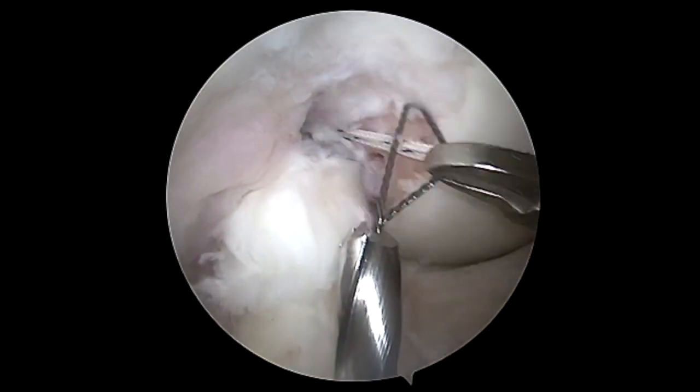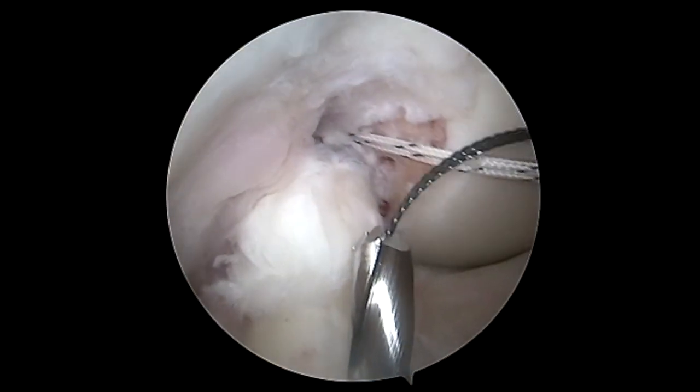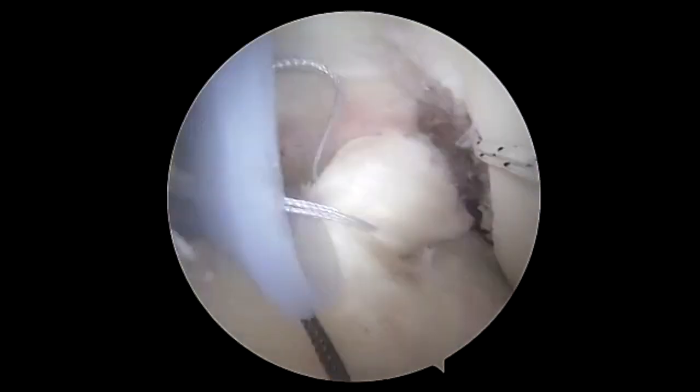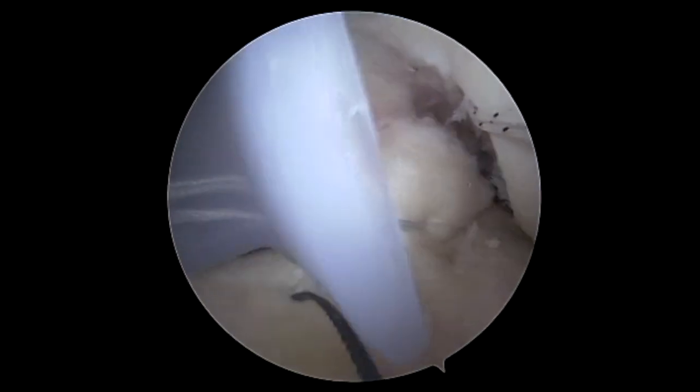This is a cannulated drill. You can see we're grabbing this out of the lateral portal again to avoid any suture tangling. This is a fiber ring, 35 millimeter.